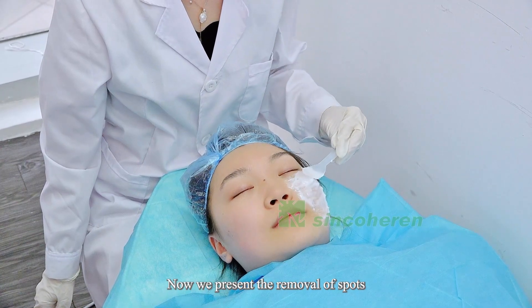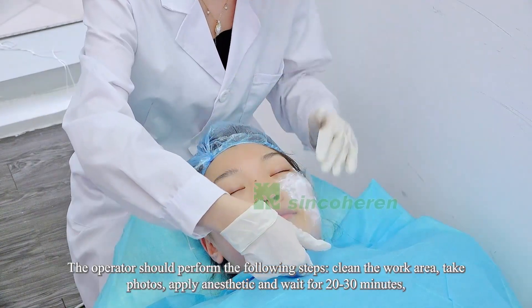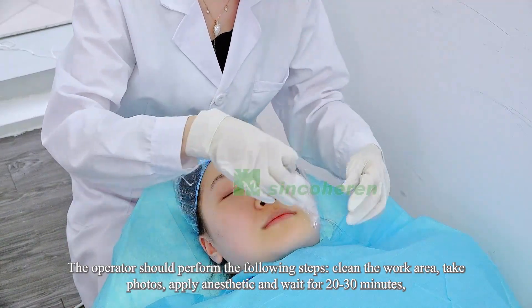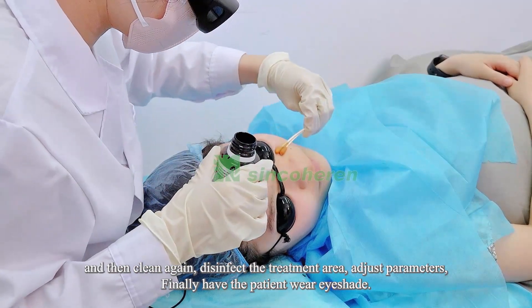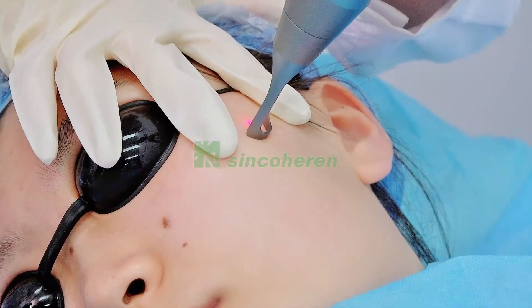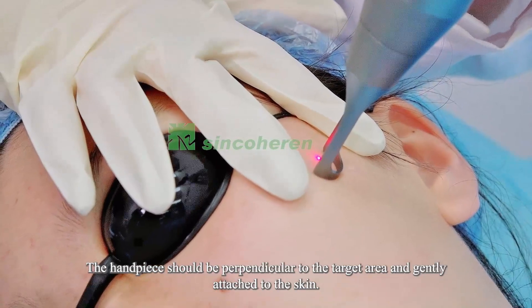Now we present the removal of spots. The operator should perform the following steps: clean the work area, take photos, apply anesthetic and wait 20 to 30 minutes, then clean again, disinfect the treatment area, and adjust parameters. Finally, have the patient wear an eye shade. We should conduct a sensitivity skin test before treatment.